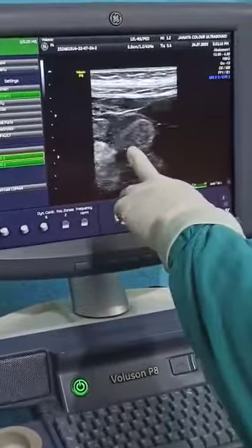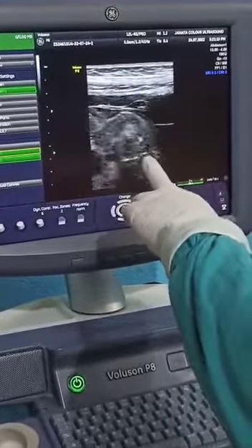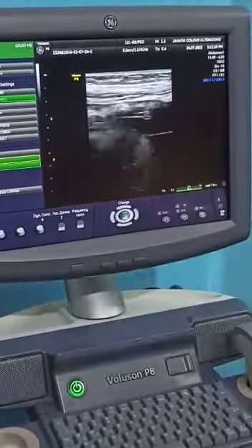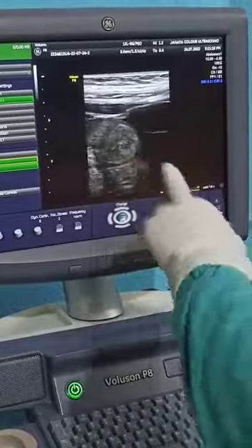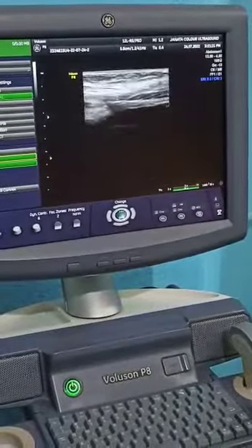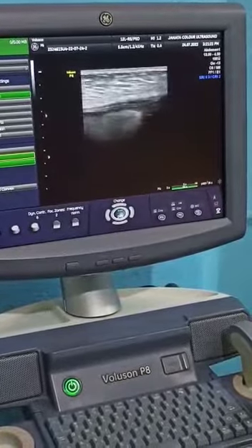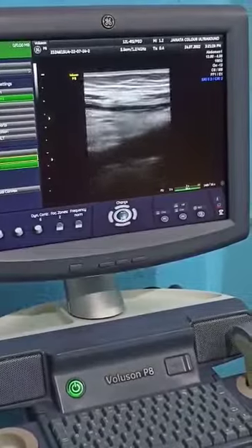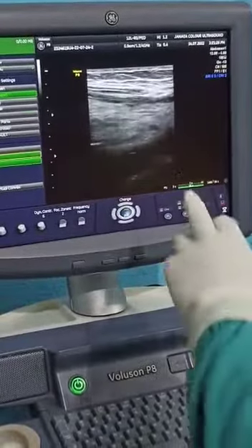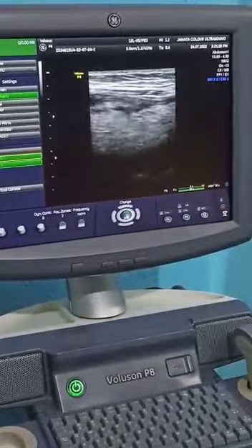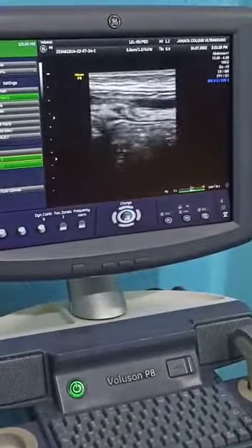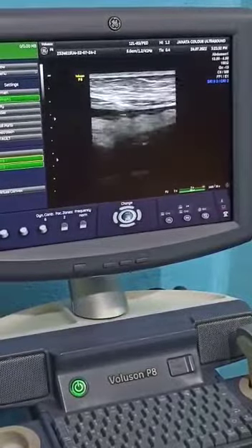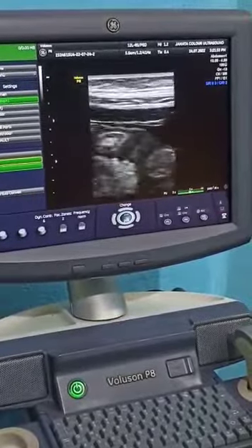This is the bowel loop. Bowel loops are also inflamed — the wall is also thick. This is an inflamed bowel loop; you must be noticing the echogenicity of the bowel loops. Mesenteric fats are echogenic.